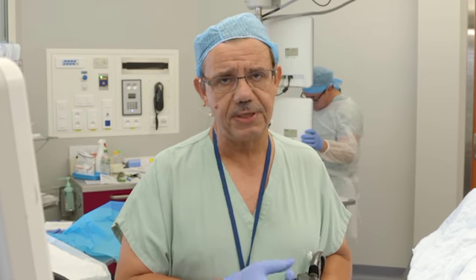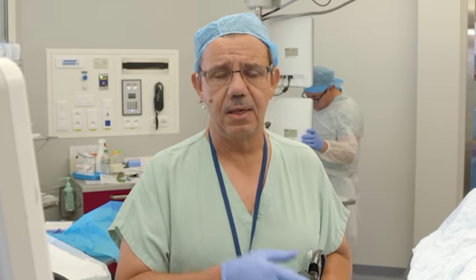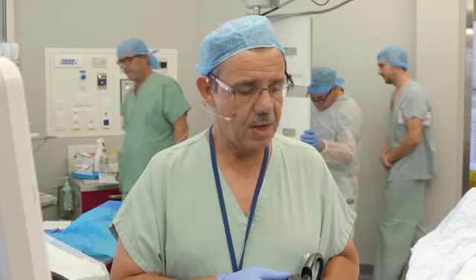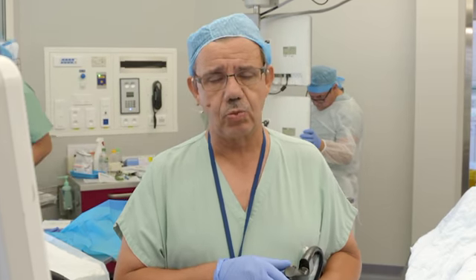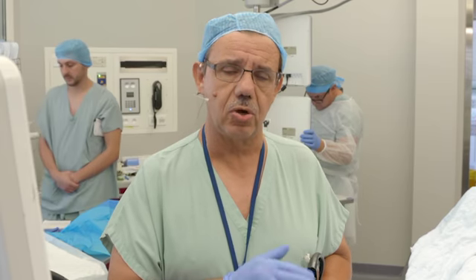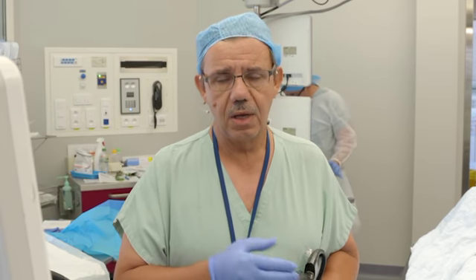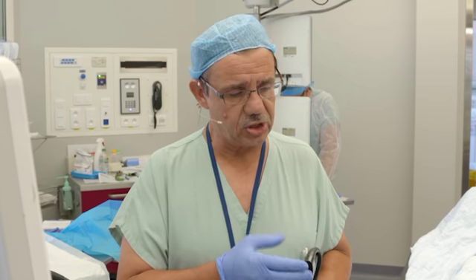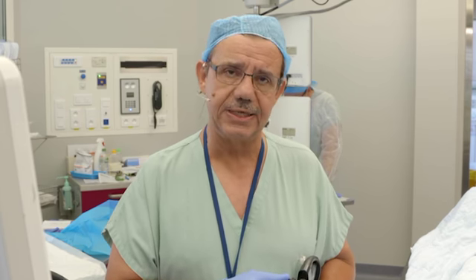And in another hospital, the patient has had the placement of a plastic stent in the bile duct. But the problem today is that we don't have a correct staging of this ampullary lesion. And also the patient has a recurrence of the jaundice.